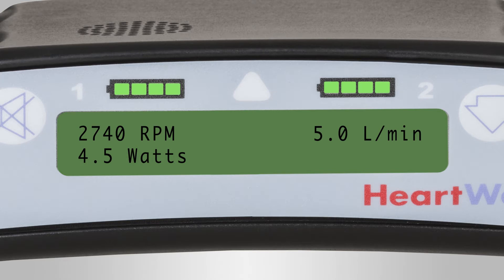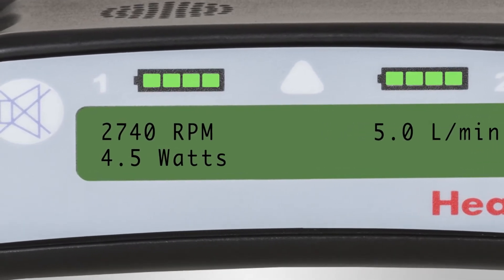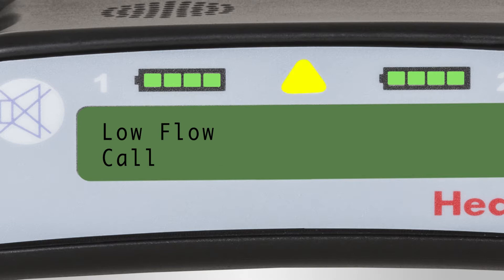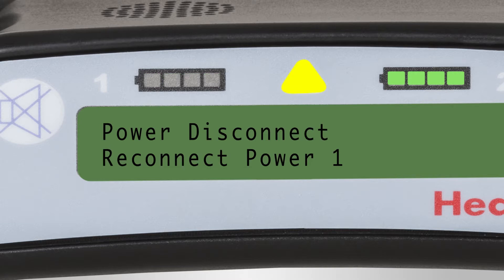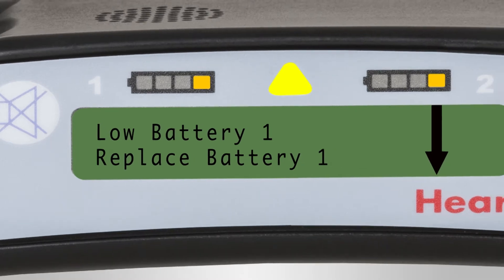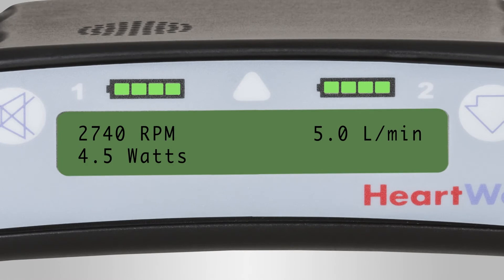There are various alarms that tell you about the condition of the pump, controller, connections, and power supplies. Alarm conditions are classified as high, medium, or low. A high priority alarm is displayed with a flashing red warning light and unique sound. A medium priority alarm is displayed with a flashing yellow warning light and unique sound. The message on the controller screen consists of two lines of text: the first tells you what the alarm is, and the second tells you what to do. The alarm sound will stop and the alarm indicator light will go out when the alarm condition is resolved.